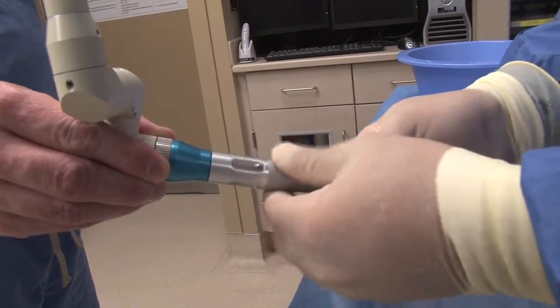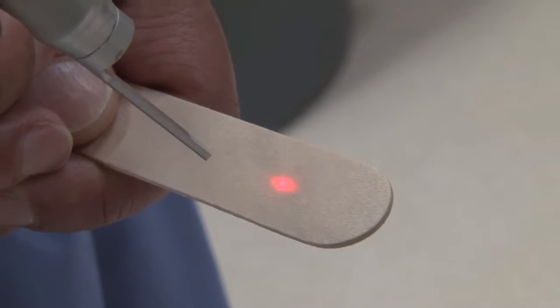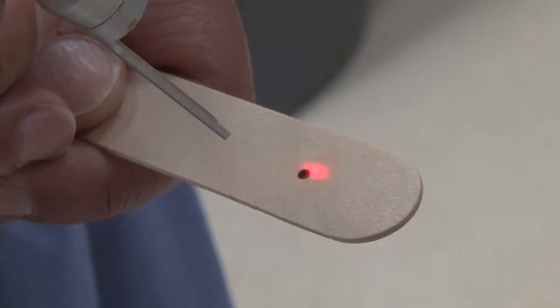If the beam's alignment is not affected, test fire the laser with the delivery device that will be used during the case. This will allow you to determine if the laser is safe to use during the case.